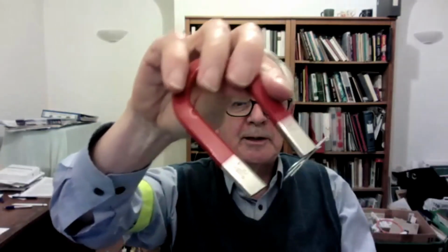Because I just want to introduce magnetism and magnetic fields, because a lot of the talk is going to be about magnetic fields. That's what MRI runs on. So I'm going to start off with magnetism and magnetic fields. I'm sure you're familiar with having a compass that measures the direction of the Earth's magnetic field. Magnetic fields have direction. And you're probably familiar with a nice magnet that we'll use to pick up the paper clips that I've lost. That also has a magnetic field running from one pole to the other.